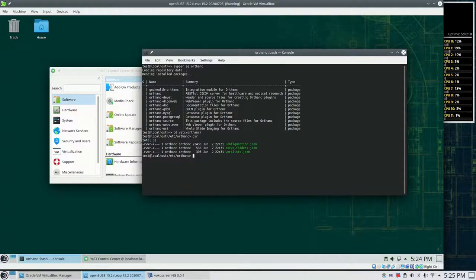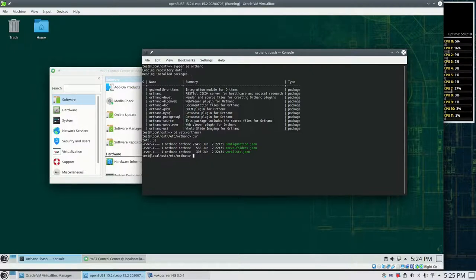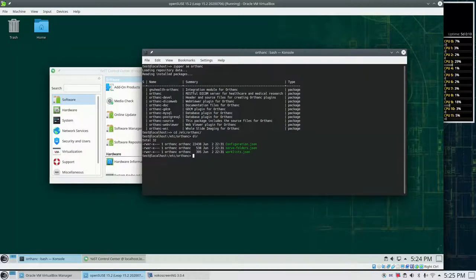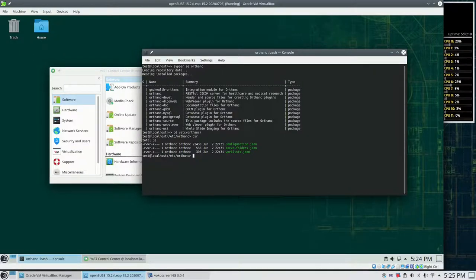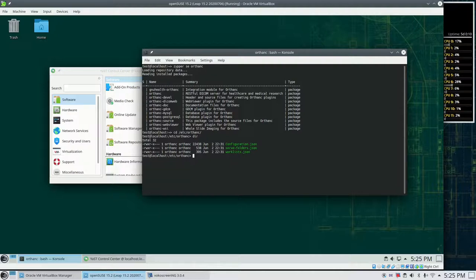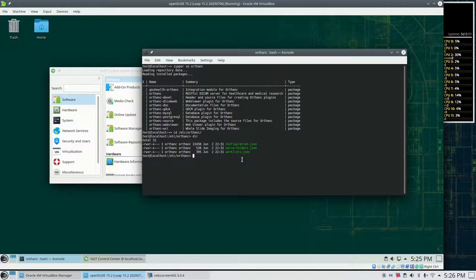So for each installed plugin I need to copy the respective JSON file into this configuration directory. But first of all, let's see what happens if we start the system as it is.